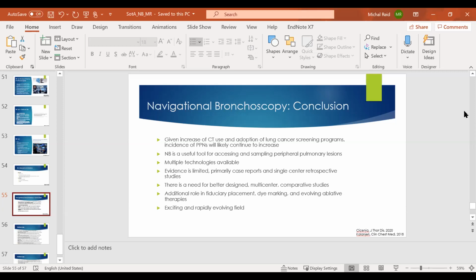That's my impression. But you're still saying that if we have a peripheral lesion, and there are no hilar or mediastinal lymph nodes, then the yield is still better with a CT guided biopsy, even though you can't stage, right? But that's assuming it's in a place the radiologist thinks they can get at, and that the patient's not at high risk for complications.